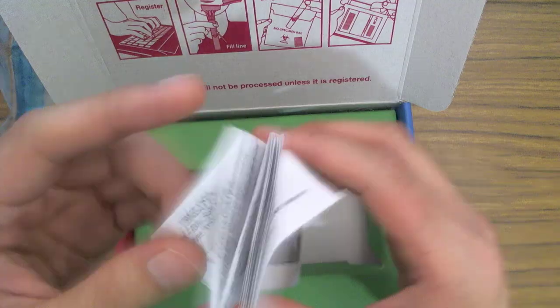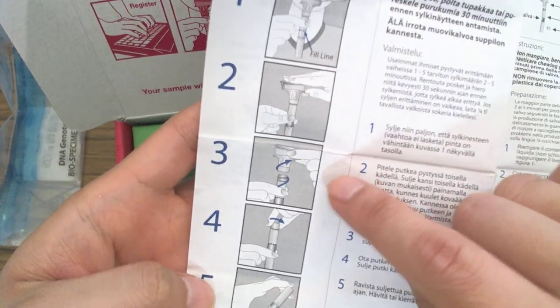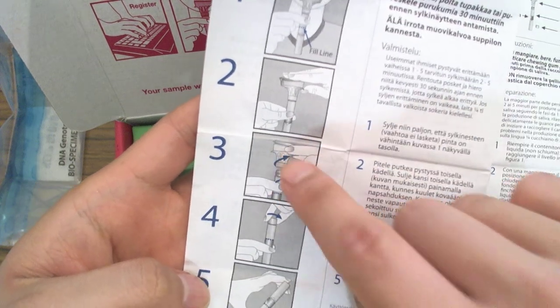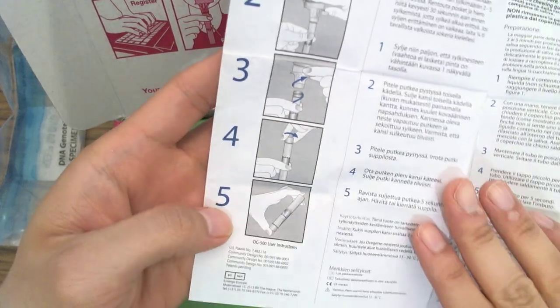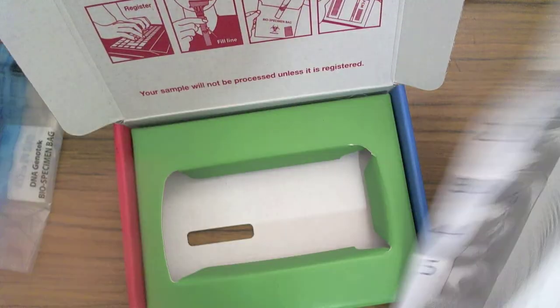Here are the instructions on how you actually spit into it, in English and a bunch of other languages — it looks like there are 14 languages altogether. So you spit it in, fill it to the line, cap it. You open that up — that's just like a funnel for you to spit into — and then you seal it with the little cap that we saw earlier, and then put it back into this bag before mailing it in.